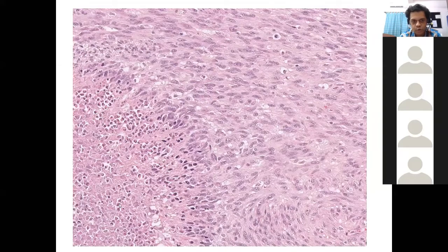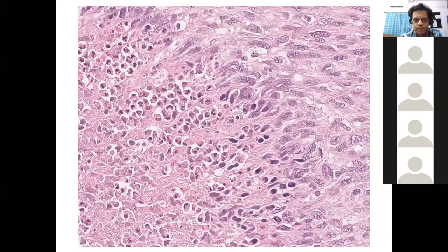So this is the zone of coagulative necrosis where you can obviously make out that the tumor has undergone necrosis. This is the tumor cell population, and here you are getting the ghost nuclei which are present within these necrotic zones. So this is the proper tumoral necrosis that we see, coagulative necrosis. For the first years, this is how we will appreciate tumoral necrosis. You have a preserved cell, and then you have these cells which are almost like going and then gone, just the vague remnant of the nucleus which is left behind. Okay?